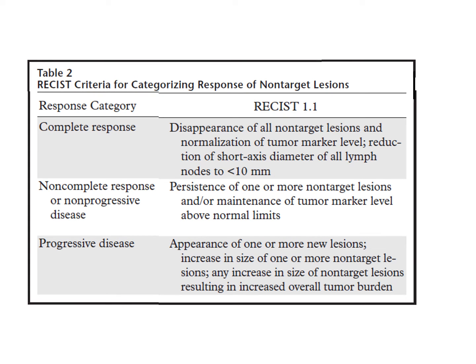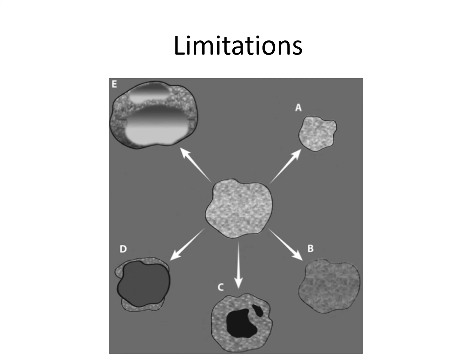Non-measurable disease or non-target lesions, that's fairly common sense, really. So that's a very useful tool. Now, again, you don't have to use that to the letter, but you can follow that principle, and it should make your reporting easier. There are limitations as well.